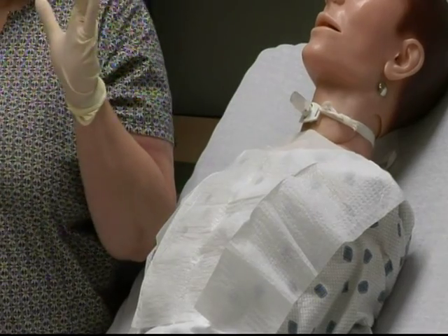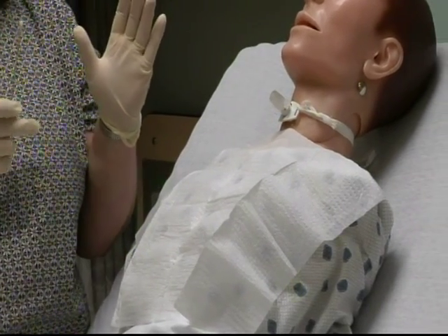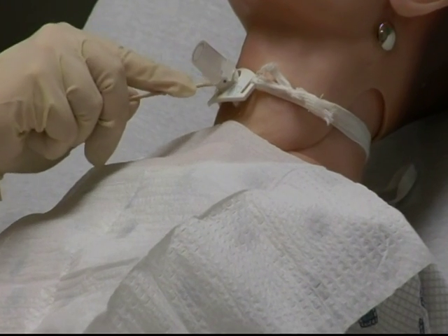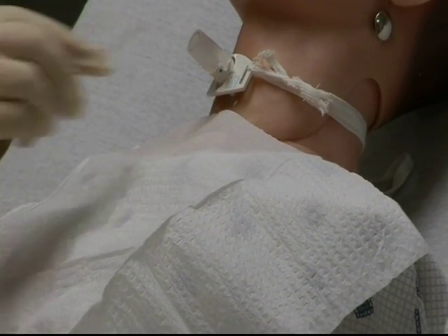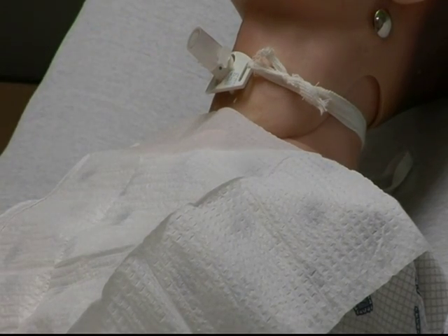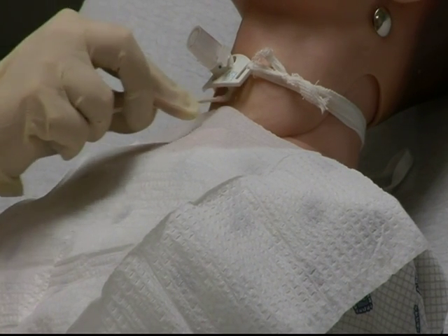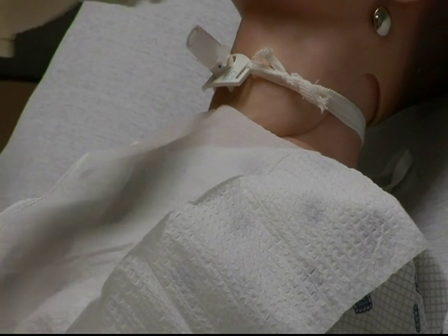Throw it away. Now you want to repeat the steps with your normal saline because peroxide is a drying agent and it will dry the skin out. Now you want to come back and clean all that peroxide off. Just repeat yourself. Your second one, the opposite side flange. Your third one, up under, make sure all that peroxide comes off. Clean it with your normal saline. Get your last one, go to the top.